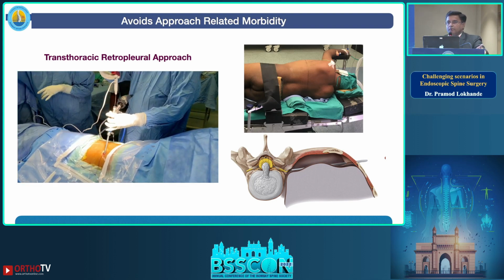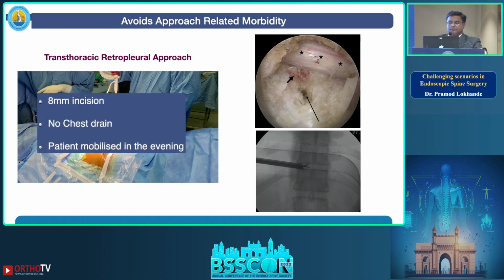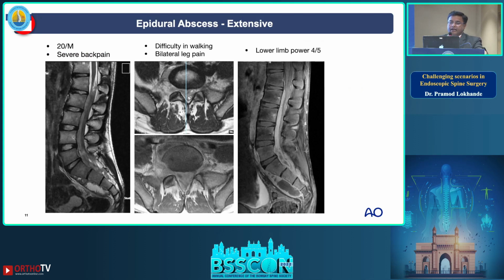You have to remove the rib head, identify the pedicle, and you have to keep on drilling till you remove the entire disc herniation. So these are the intraoperative pictures. No chest drain, 8 millimeter incision, and the patient can be discharged on the next day.